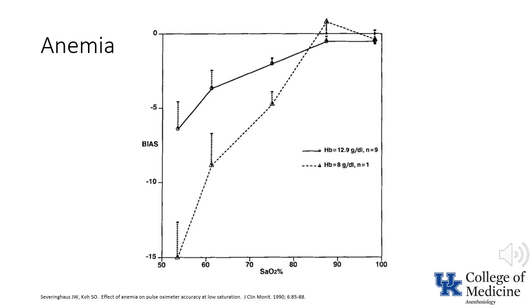Note 2 things. 1. The research was done nearly 30 years ago, and instrumentation has undoubtedly improved over time. 2. The value reported by the pulse oximeter was spuriously low. More recent studies have essentially duplicated the direction of the bias, if not its magnitude.